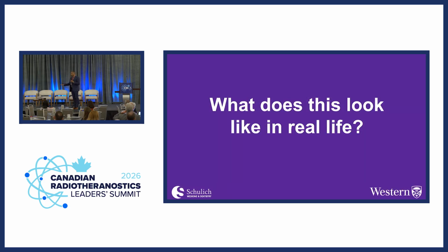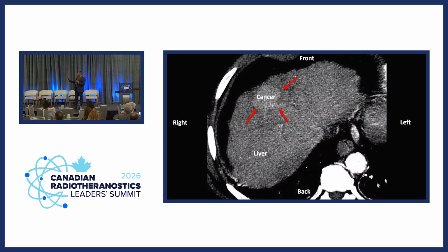So what does that look like in real life? This is a person who happens to have liver cirrhosis, and people with liver cirrhosis are screened for liver cancer. To walk you through this, you have to become an interventional radiologist, or at least a radiologist, and we can label this. It's like we're cutting you up like a piece of salami, and that big gray organ there is the liver, okay? Within the liver, we see a spot that was detected on an ultrasound and got further workup, and that in fact is a small liver cancer.